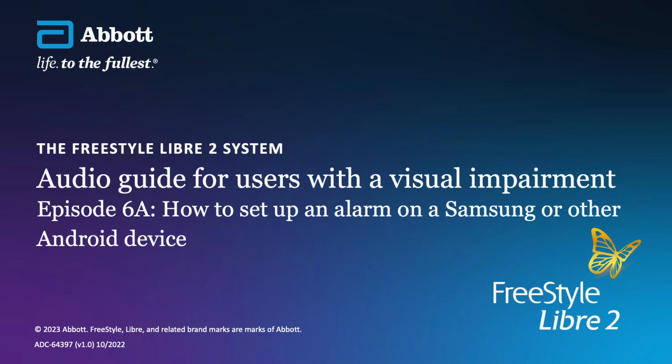Signal loss alarm. Selecting the signal loss alarm option will take you to the signal loss alarm screen. At the top of this screen and to the right-hand side is an off switch. Selecting this will turn the signal loss alarm on. The signal loss alarm will notify you if your phone loses Bluetooth contact with the sensor for a period of more than 20 minutes. There are alarm tone and override options available on this screen, the same as on the glucose alarm screens. You're all set.